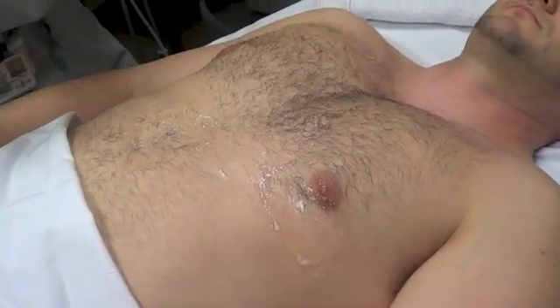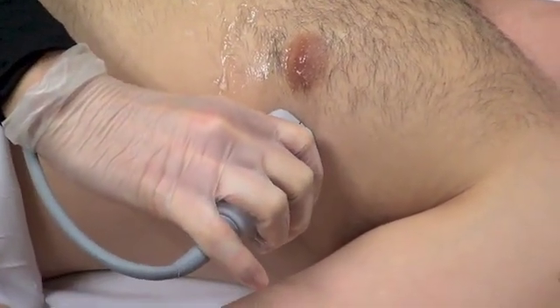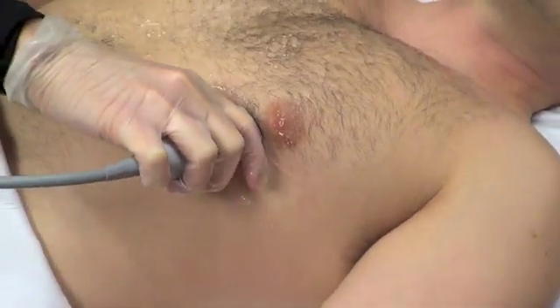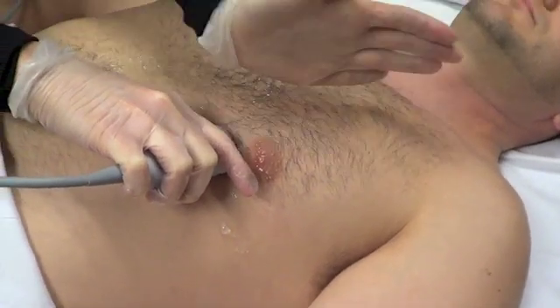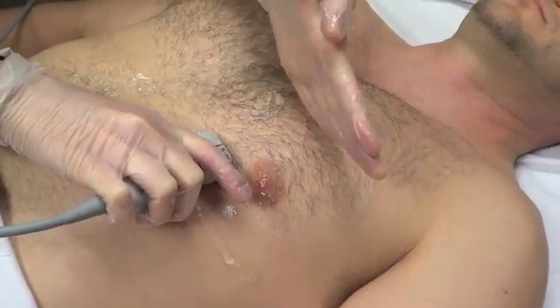For the four-chamber view with the indicator towards the left axilla, in COPD patients you may need to slide around and come more anteriorly to get your view because COPD makes the heart more vertical. In obese patients, the heart may be more horizontal. These are special cases to think about that may change the position of your probe when trying to get adequate cardiac views.